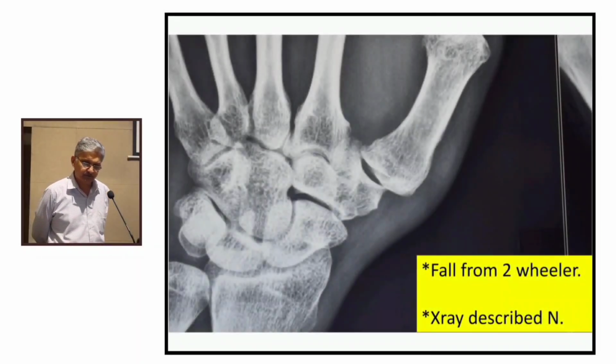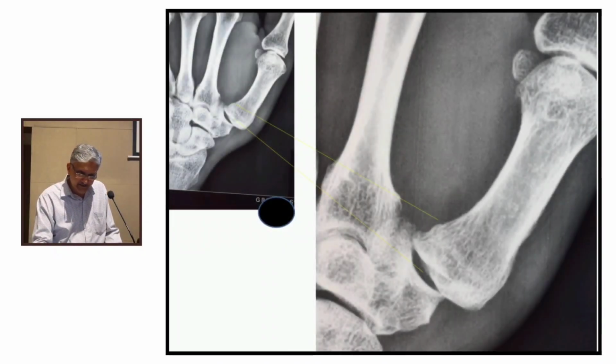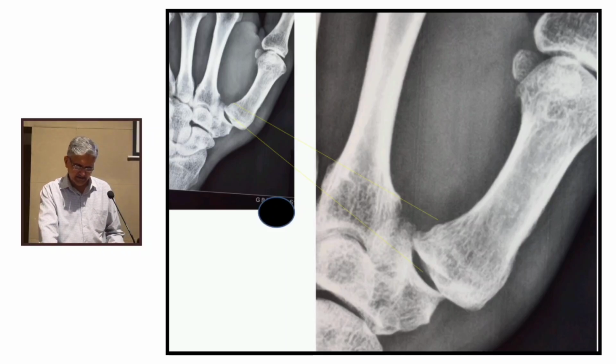This patient had a fall from a two-wheeler, and the X-ray is described as normal. Now if you see a magnified view, this part is overlapping, and you see this is convex and this is convex. So there is a double convex of the base, and there is a shadow away from the base. So probably something is happening, and we had this X-ray and we are missing something, and the patient has pain.